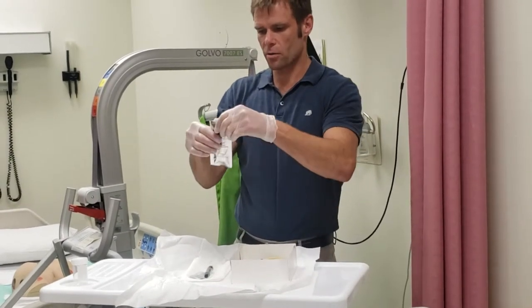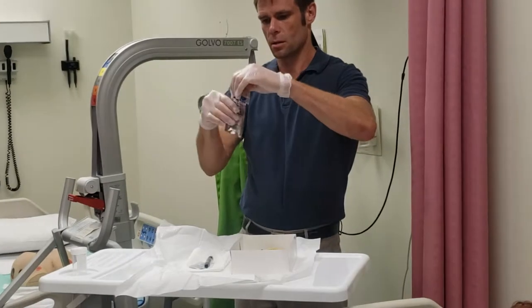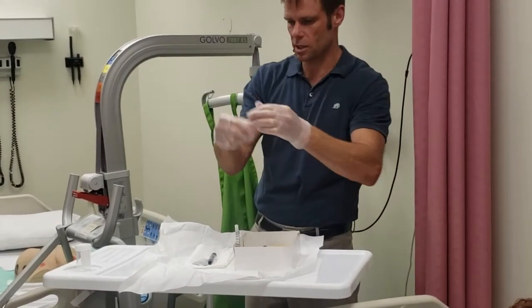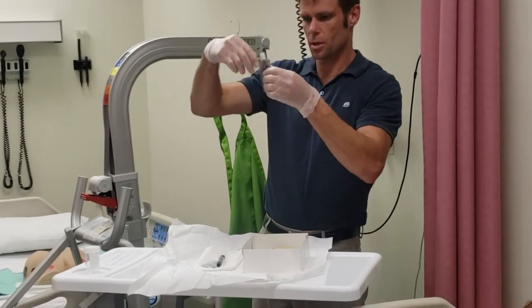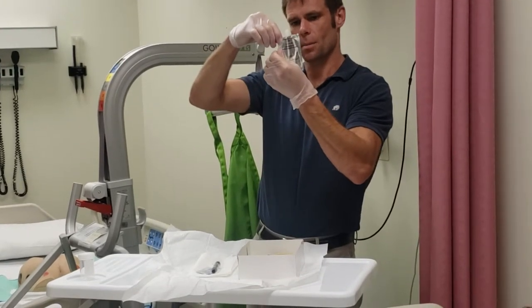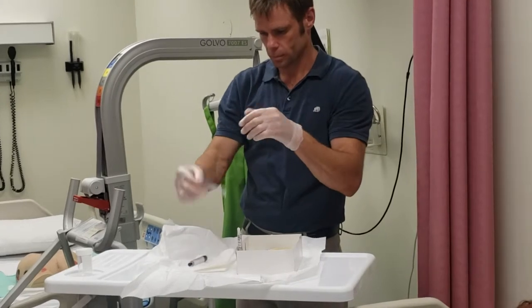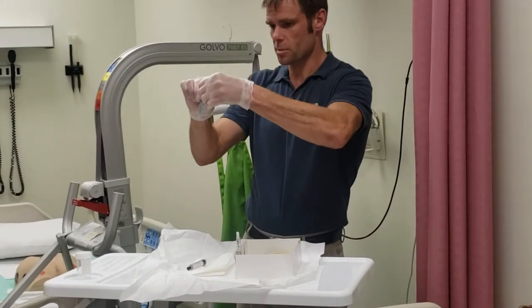I like to open up everything over here before I go over to the patient. These are my cleaning sticks. These ones happen to say just 'skin cleanser' — it doesn't tell me what the chemical is.